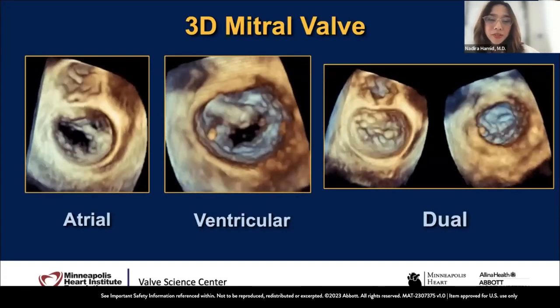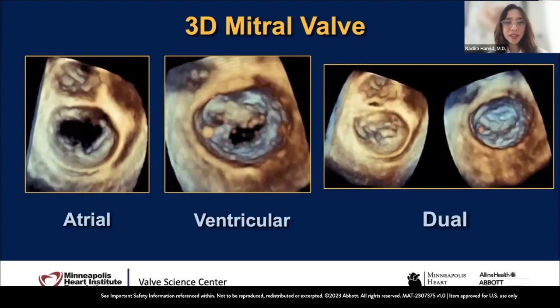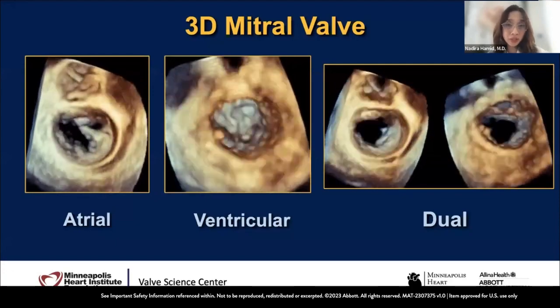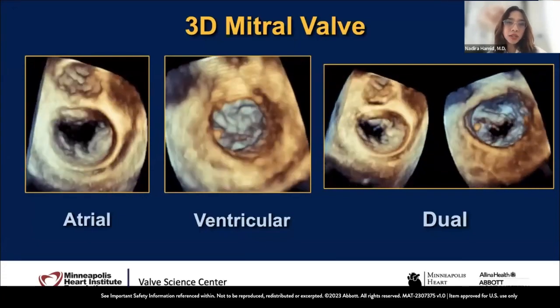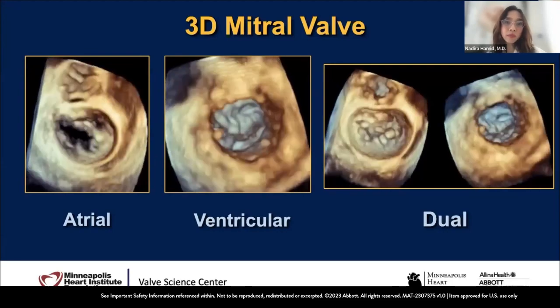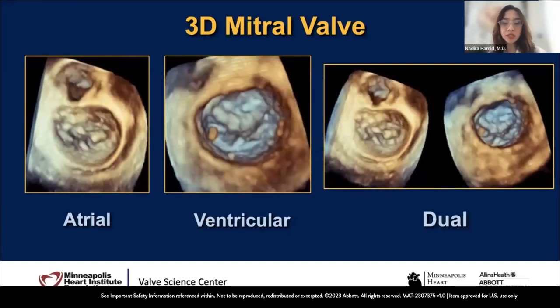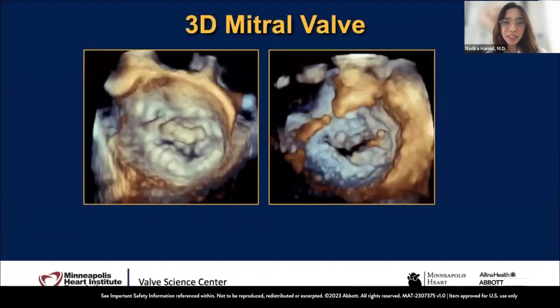And one of the key things I do, Ryan, is that looking at the ventricular view, you can see a little indentation. You can see right next to the A2P2 on the medial side, like a little fold, and you can also determine if the patient has a cleft as well, a deeper fold all the way to the annulus. I think this is so key. So to really understand the anatomy of the mitral valve and understand the etiology of where the mitral regurgitation jet is, because of planning during the MitraClip process. So I love this view, atrial and ventricular, to have a real understanding of the mitral valve. And this is a case I actually just did last week.